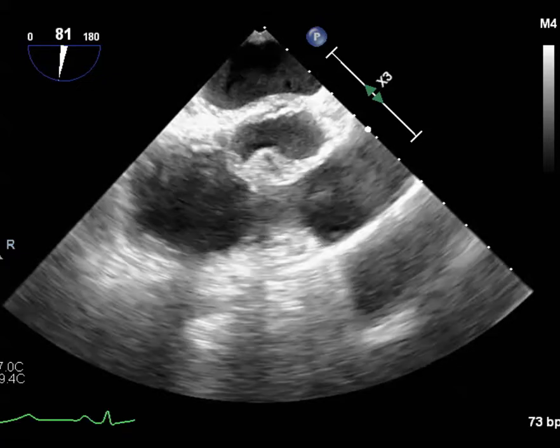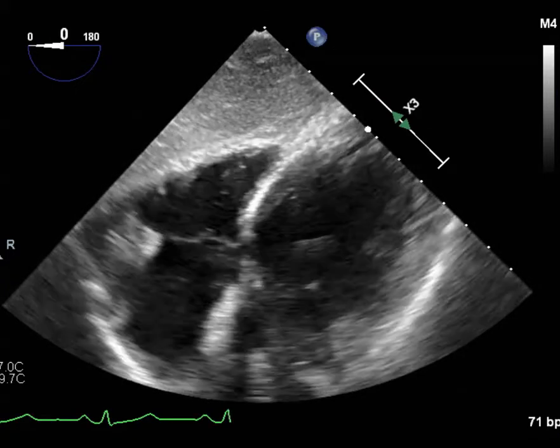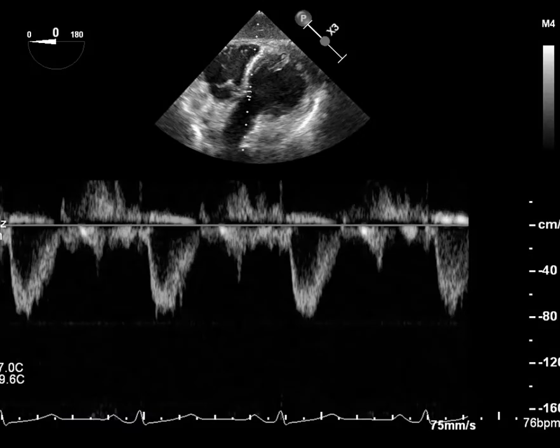So I'm going to have to be a little bit creative here, so I'll show you what I did. I'm going to start off with a gastric view. I'm going to turn it a little bit to get my five-chamber view, and I showed my five-chamber view here, and this is my LVOT outflow. The LVOT outflow VTI came up to be about 15.2.